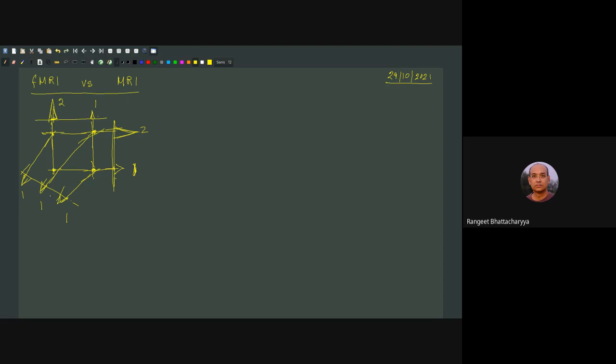And then if you calculate diagonally, sorry, this should be 2. It's passing through 2. So if all four intersections are present, you will have 1, 2, 1. If this one is not there, what we originally thought, my apologies, there should not be anything here.